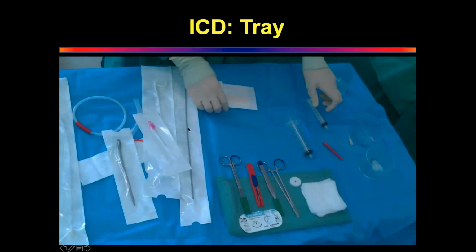What is this? This is the sheath. And what is this? That is the pigtail catheter. Pigtail catheter. Okay, thank you very much.